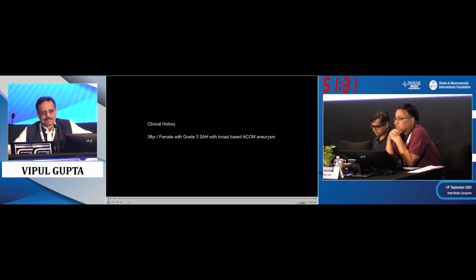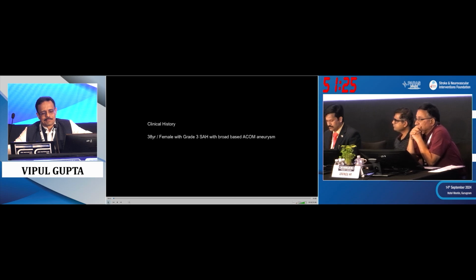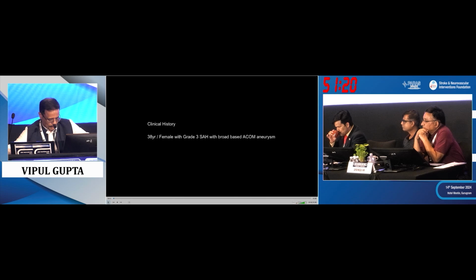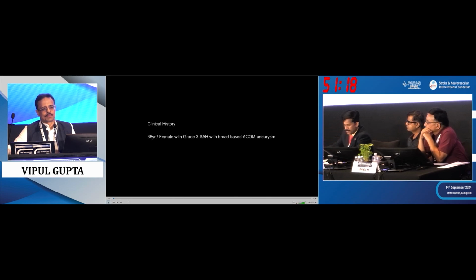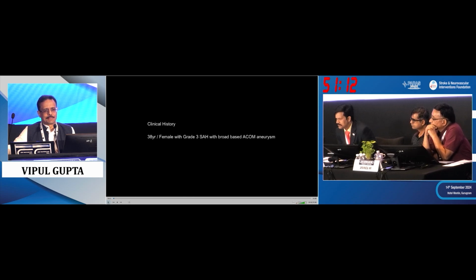I have cases I showed during the course here, but I cannot show them again. Where it's really dysplastic, we go for stent and coil, even with a grade 4 and a hematoma in the Sylvian fissure. We just use cangrelor, monitoring the P2Y12 inhibition rate up to 50%, not 100%. Then we do the stent and coil with a brain hematoma in the patient.